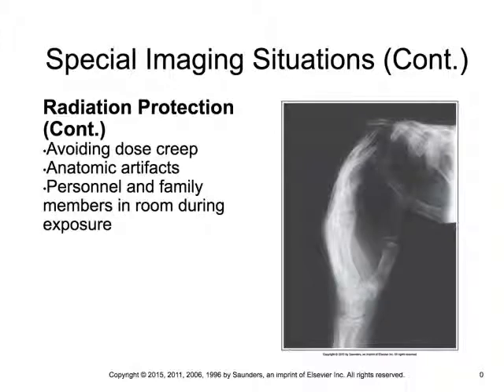I've obscured part of the distal phalanx of the first digit with this joint here, and I'm also obscuring things here due to overlap. And I've unnecessarily exposed someone's hand, right? And then also being aware of who is in the room with us. Are there family members with us?